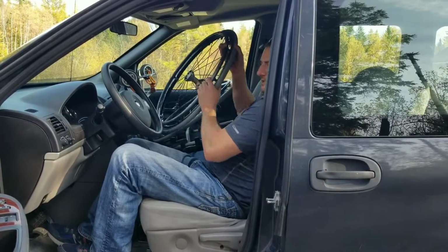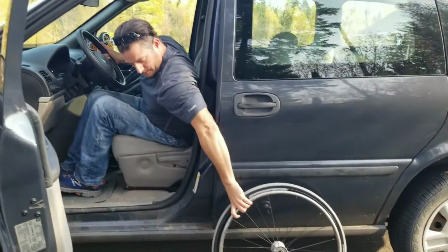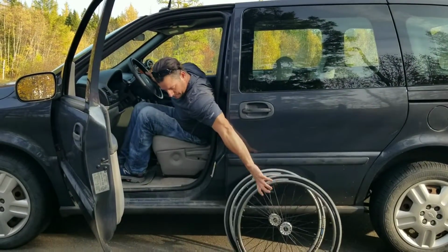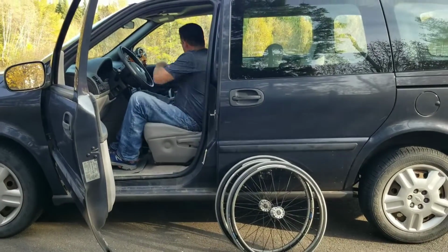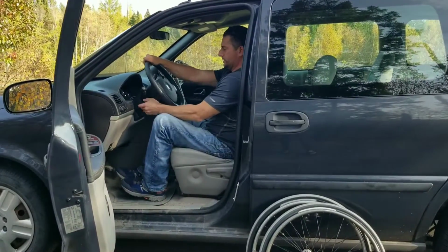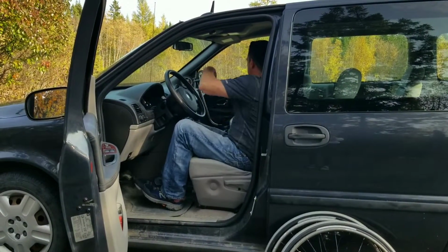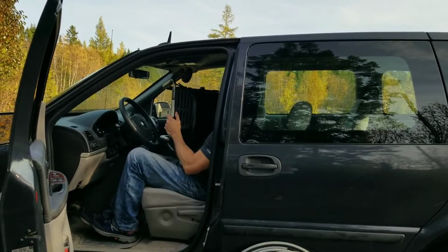So I'm going to take my wheels out first. Put them alongside of my van. Make sure they don't roll away on me. Again, I'm going to make sure the steering wheel is up high. It's adjustable. I'm going to put it as high as I can go. Put my seat back so I have all that clearance, so I won't mark anything up. I'm going to bring the chair across.